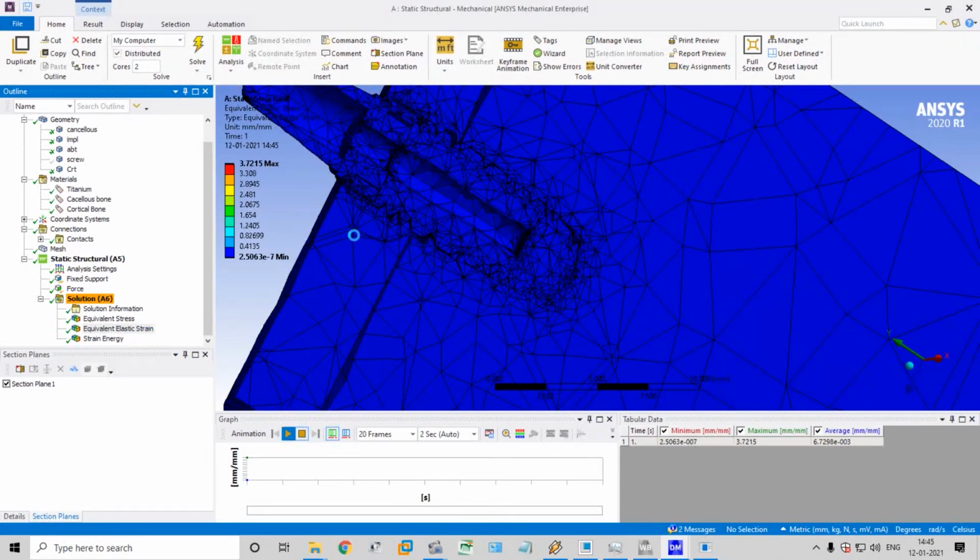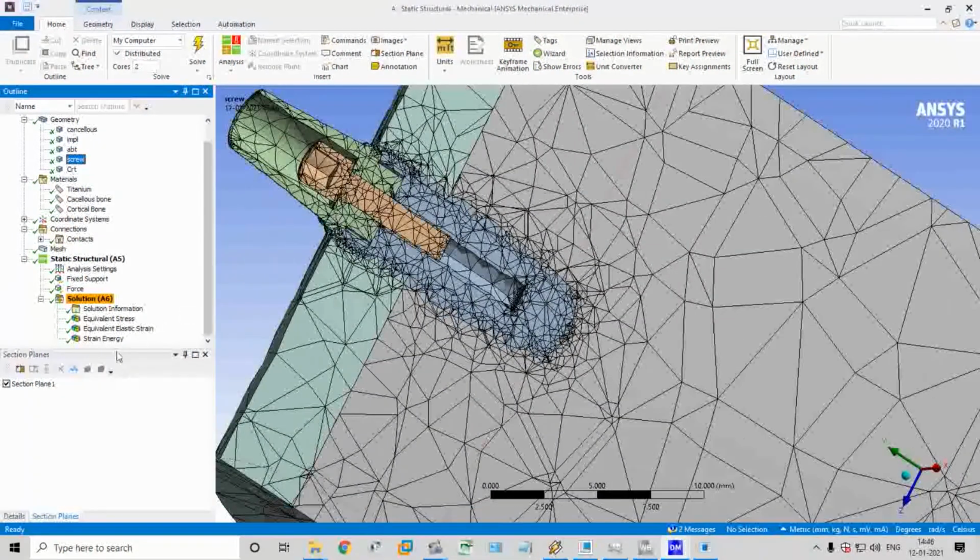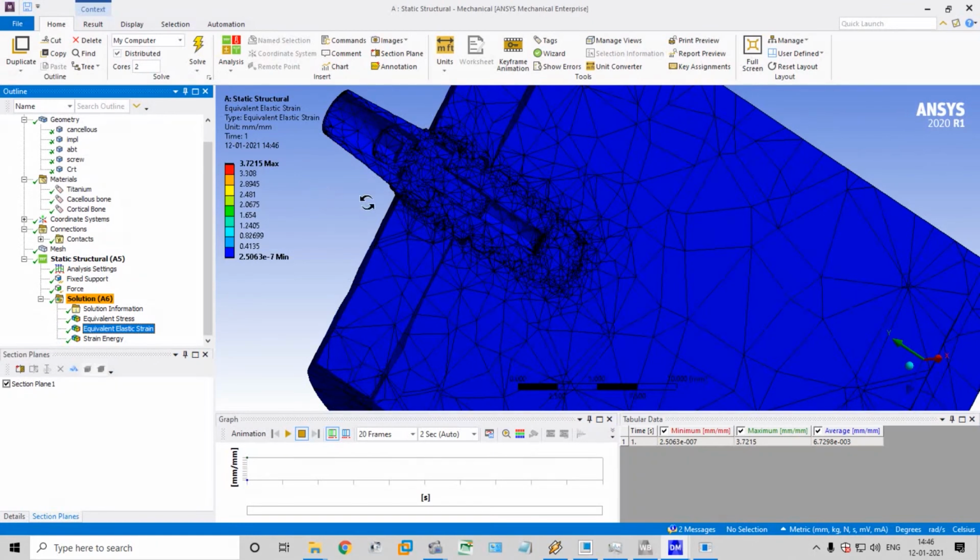Let's play the animation, because the elastic strain can be seen. Let's stop this. And the keyframe animation menu will be there. Then show the screw. You can see this. Okay, elastic strain. That's all about the axial load in this y direction. Next we can apply in the z direction, mesial loading.